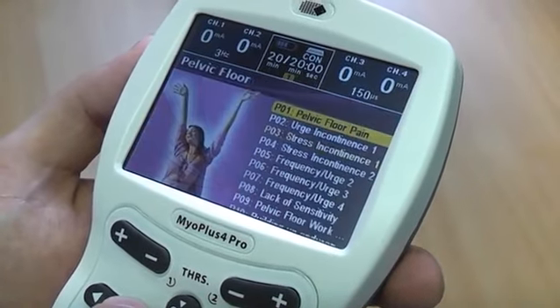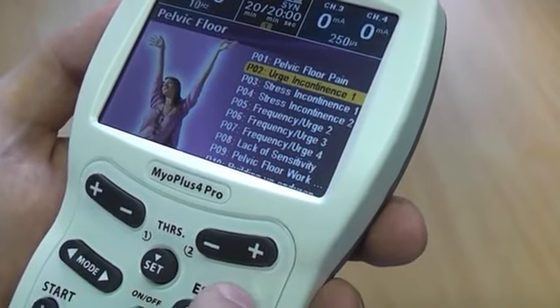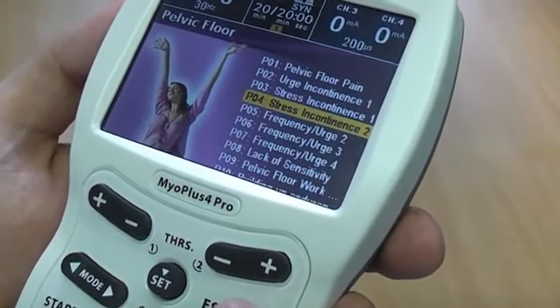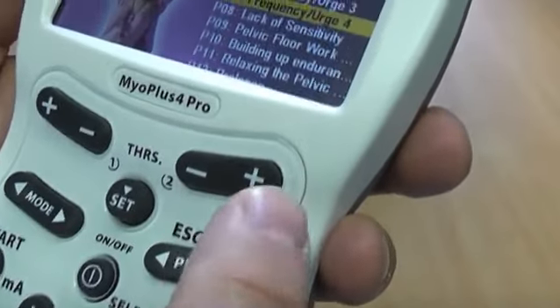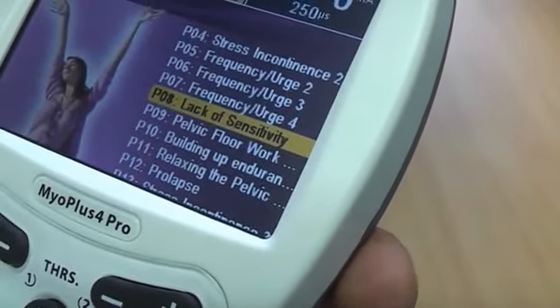Keep pressing the mode button until you reach the incontinence mode. Now press the program button to select one of the preset programs, for example stress incontinence, frequency and urge incontinence, or lack of sensitivity.